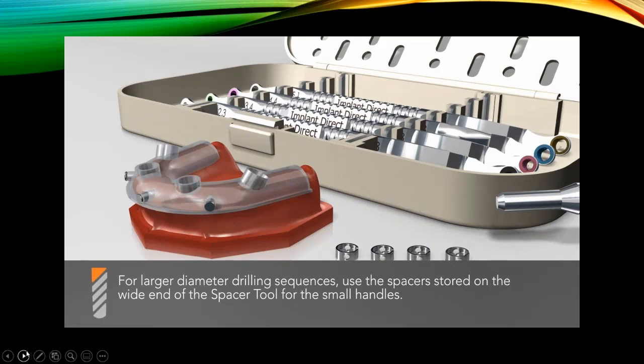Very good. So I hope that helped understand step by step how that works. And so, again, what the drill protocol gives you is some of those offset numbers to know the height of where those drills will go to bottom out, if you will, with that sleeve. And each step in the key kit incrementally corresponds to a larger drill to arrive at your final osteotomy.